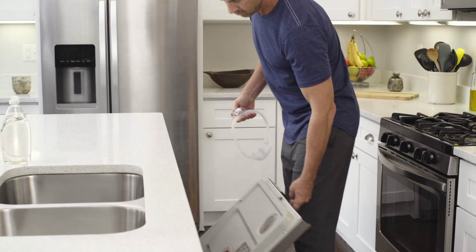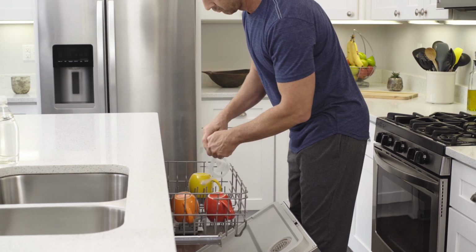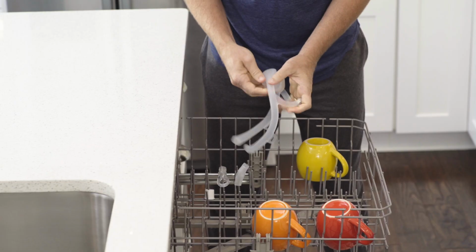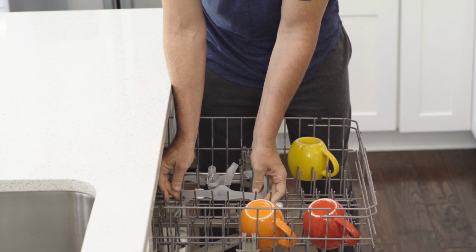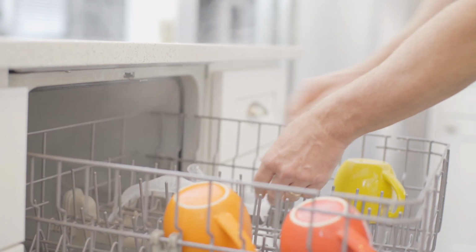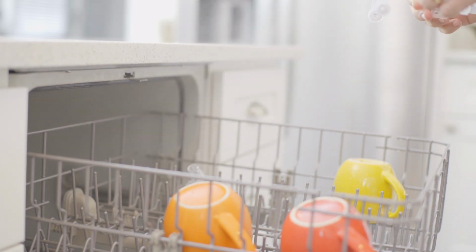In addition to daily hand washing, you can place these mask parts without the magnetic clips in the dishwasher for cleaning once a week. Use a mild detergent and carefully position them on the top shelf so water can circulate within the mask frame. Do not use the dishwasher's drying cycle. Instead, remove the parts and allow them to air dry.